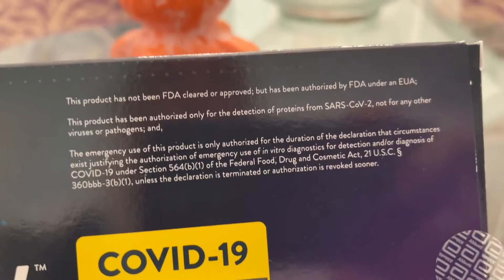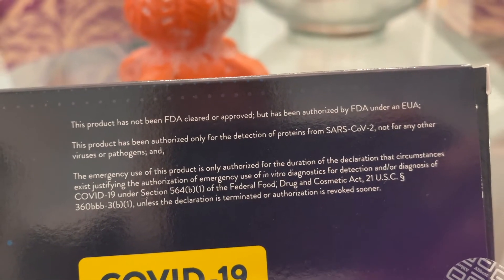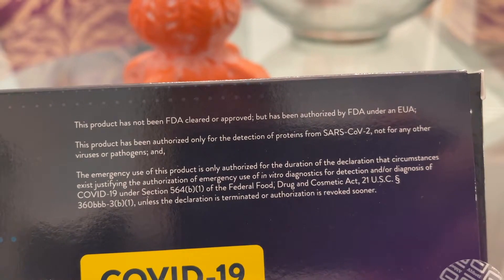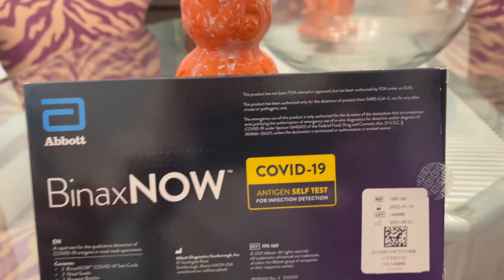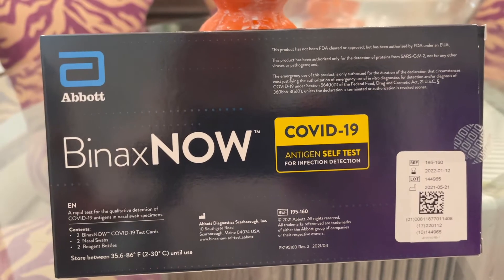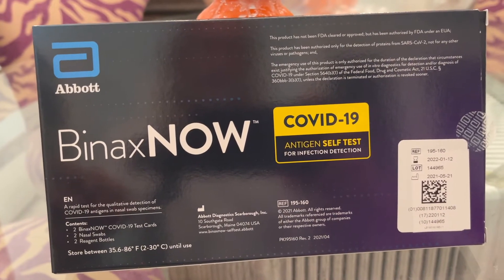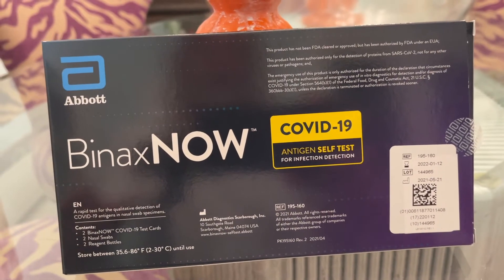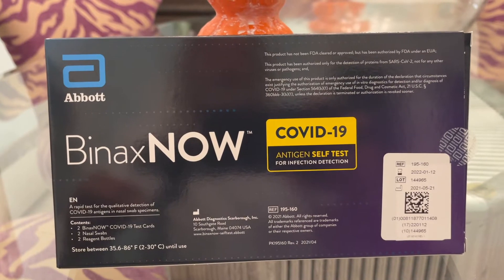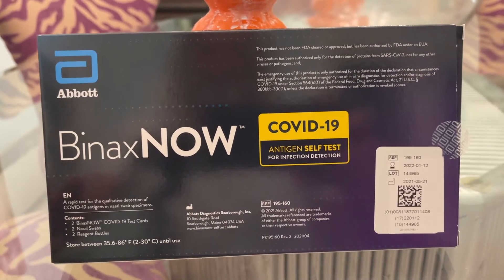If you notice up here, it says the product has not been FDA cleared or approved, but has been authorized by the FDA under the EUA. You can get false positives and you can get false negatives. So if you get a negative, you better not have false confidence — you might still have to go to a doctor and see what's up.